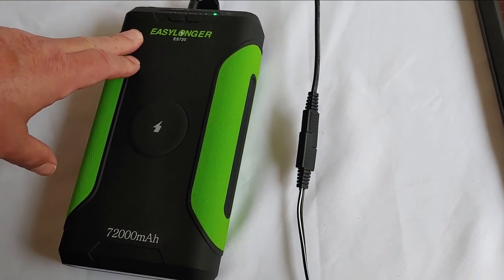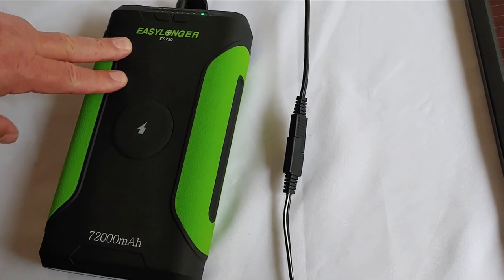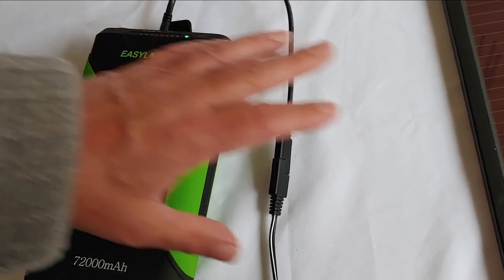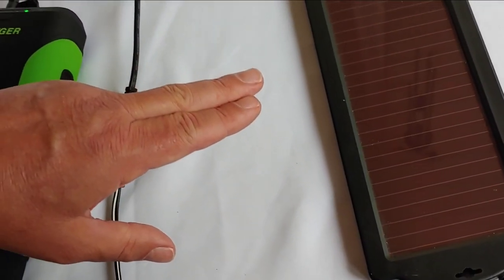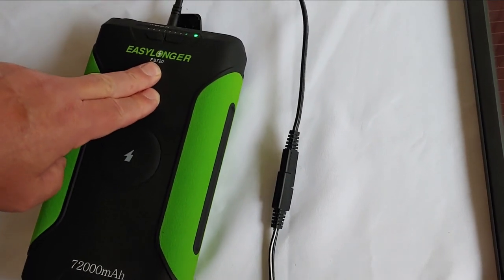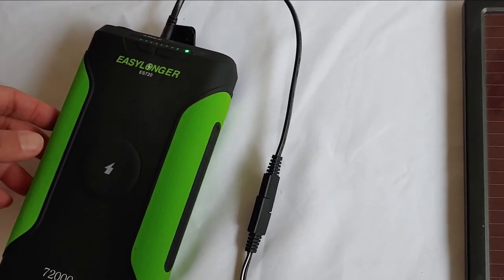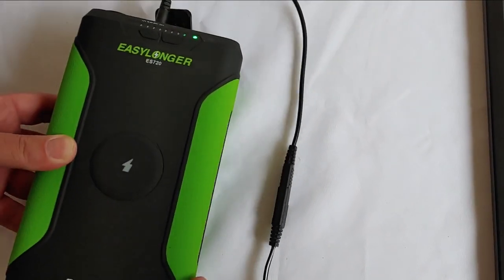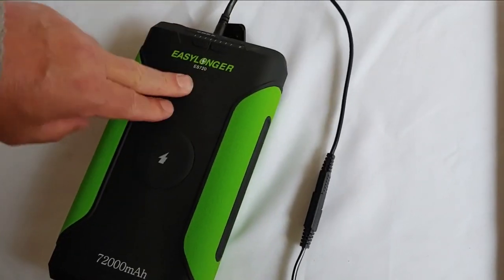How long will it take to charge it up? Well, of course, it depends how drained it is and the size of your solar panels. Naturally, a 1.5-watt panel is going to charge it up much slower than if you have a 100-watt solar panel. So just keep that in mind — that is simply how easy it is to take one of these battery packs and charge it up with solar.